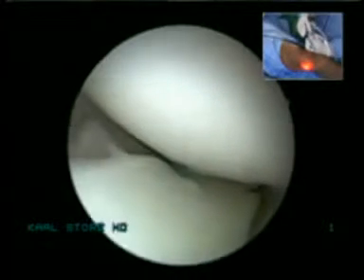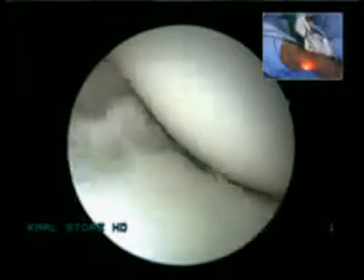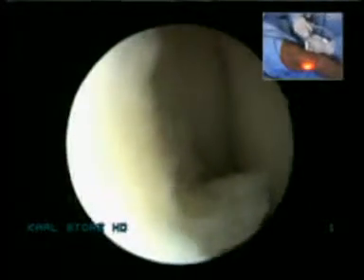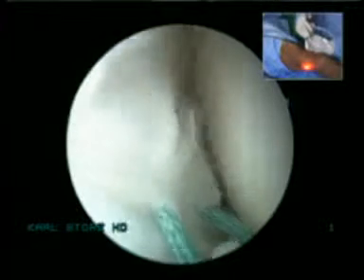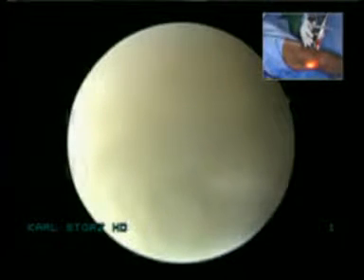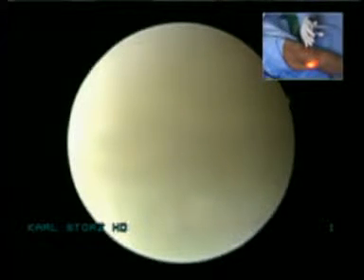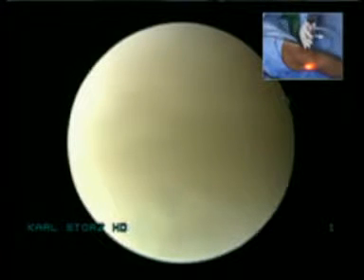Sean, your views on outside-in suture? I do. I can preserve all meniscus. Almost the only thing I would question is whether you can actually reduce it or not. I think that's the absolute fundamental thing. It's got to sit looking anatomical before you start to put your sutures in. And I do exactly the same. I fix the posterior horn with fast fix. I try to put two or three on the top and one on the underside to pull it all back down. And then peripherally, I use a double barreled Tikron suture kit. So not inside-out at all.